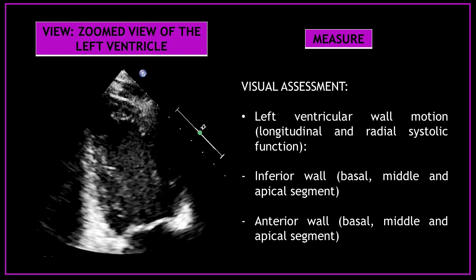Now obtain a zoom view of the left ventricle and perform a visual assessment of the left ventricular wall motion. Analyze the longitudinal and radial systolic function of the inferior wall and anterior wall.